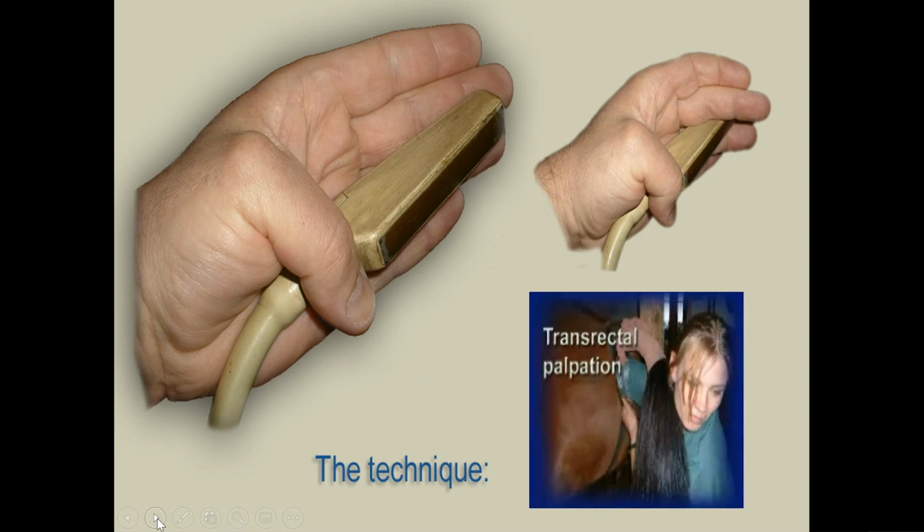You don't want to be pushing the transducer forward without your fingertips in front of it, because your fingertips are what are sensitive, and that'll allow you to know if the transducer is being able to move freely or not. So modern transducers are actually a pretty similar size to this one. So they should fit neatly in the palm of most people's hands. And it's always a good idea to have your fingertips slightly ahead of the transducer face.